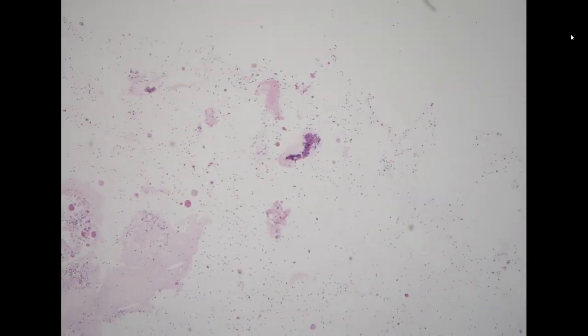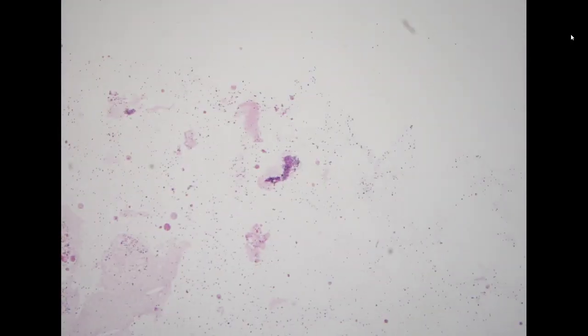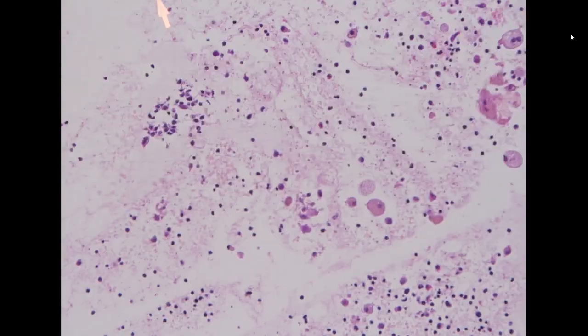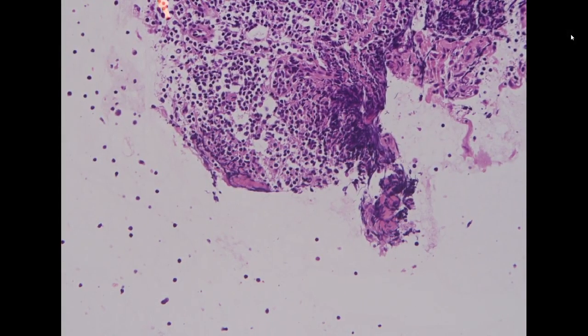So this is the cell block preparation. There are more cells over here. Basically, we see similar findings: lymphocytic stroma, cystic background, just more of both.